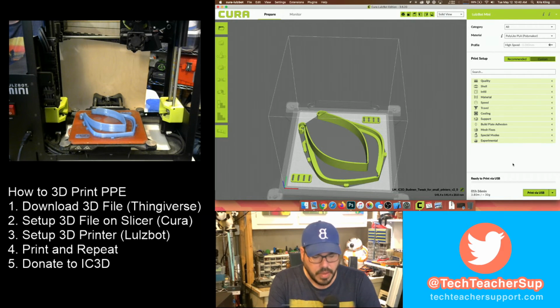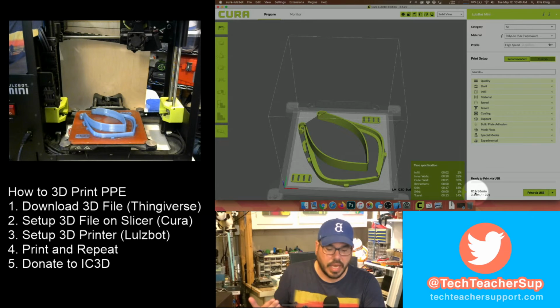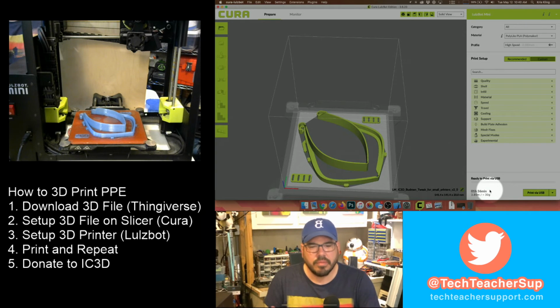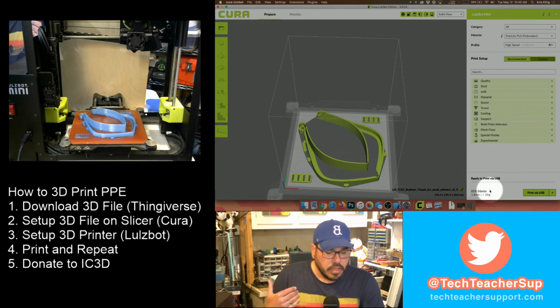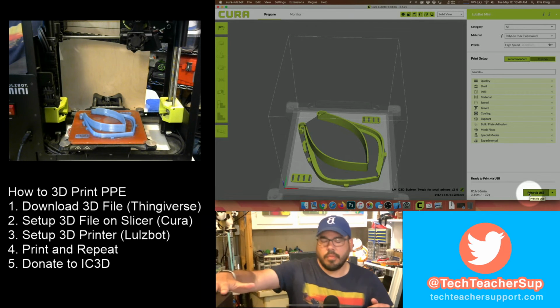Right down here at the bottom, you see two things. One, it gives you an estimate of the time. So it's going to take about 1:36 hours. And after everything is said and done, it's probably closer to 2 hours. And then right here is this print button. We are ready to print. We're just going to hit this and our printer should go.